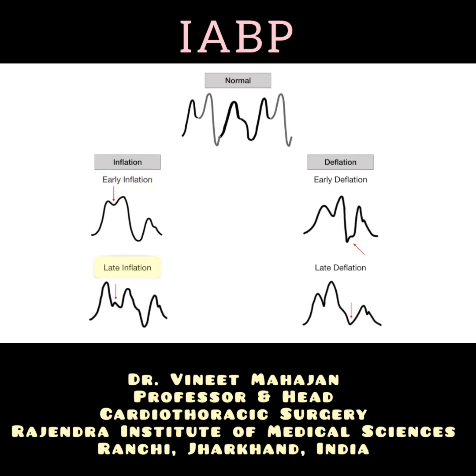Late inflation is inflation that occurs long after the dicrotic notch and allows too much blood to leave the left ventricle, and thus lessens the diastolic augmentation. Early deflation is deflation that occurs prior to diastole finishing. This results in a loss of the beneficial effects of afterload reduction. Late deflation is deflation that occurs long after and encroaches on systole. This results in an increase in afterload.